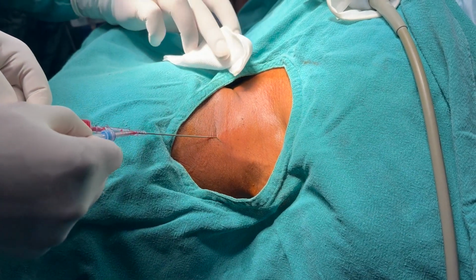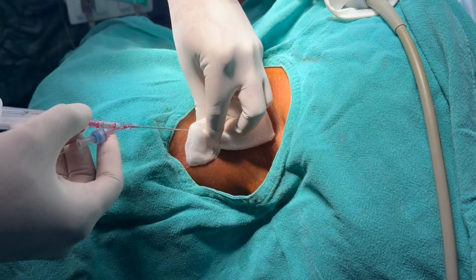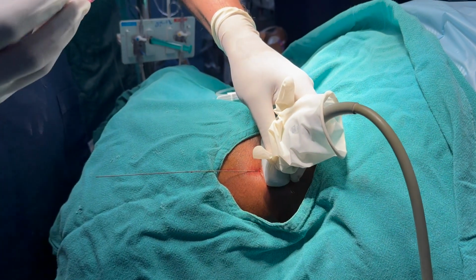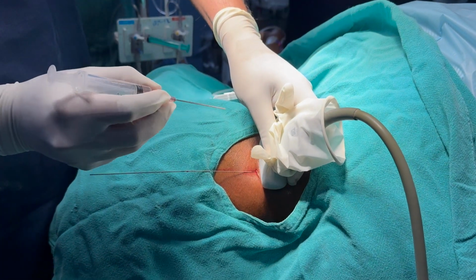Okay, so now remove the puncture needle while holding the guide wire.